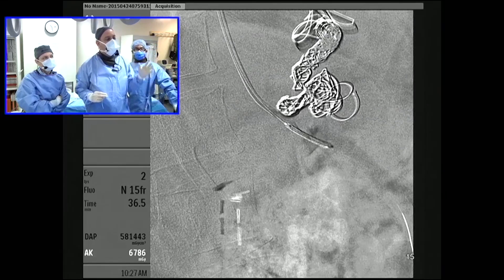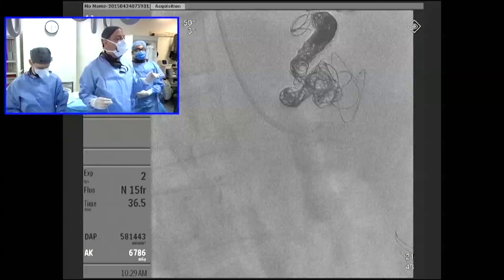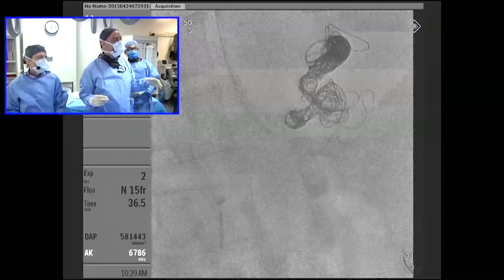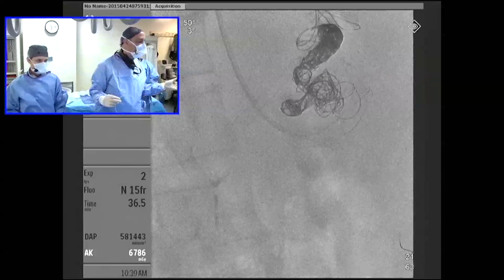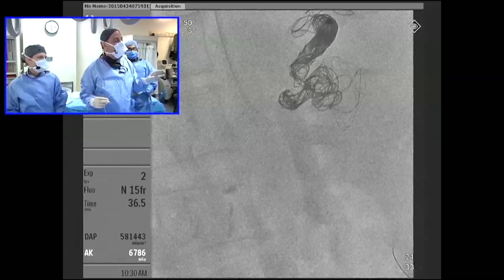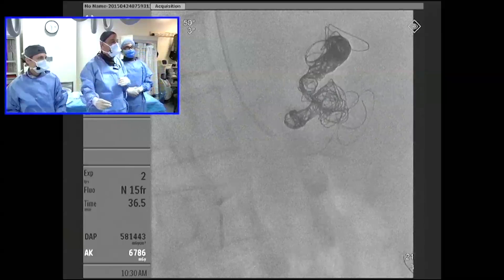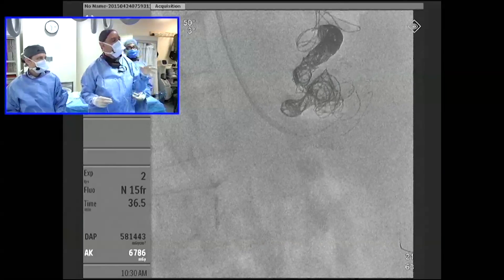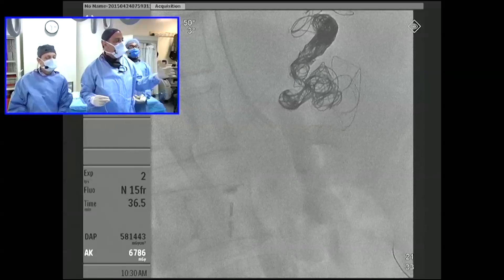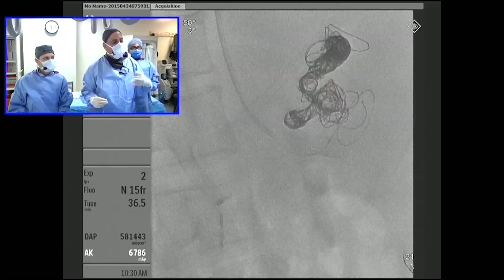You can't look at this enough times to be sure we're exactly perfectly centered on the neck of the aneurysm. On the bottom right of the screen, we left the stabilizer wire in — our preferred support wire when doing visceral and renal stenting — to make sure that the guide wasn't just floating in the aorta. For this kind of stent-assist case, you really want the stent and guide to be completely stable. As you can see, there's a tremendous amount of tension in the microcatheter system, and without that stabilizer in the distal SMA, we likely would have prolapsed the microcatheter into the aorta. We've gotten the microcatheter through the interstices of the stent, sitting in the celiac artery.